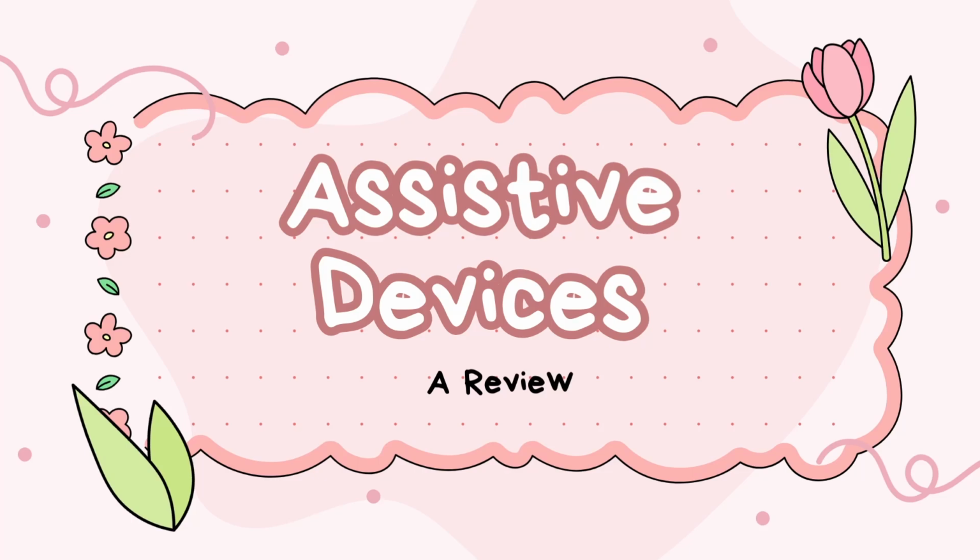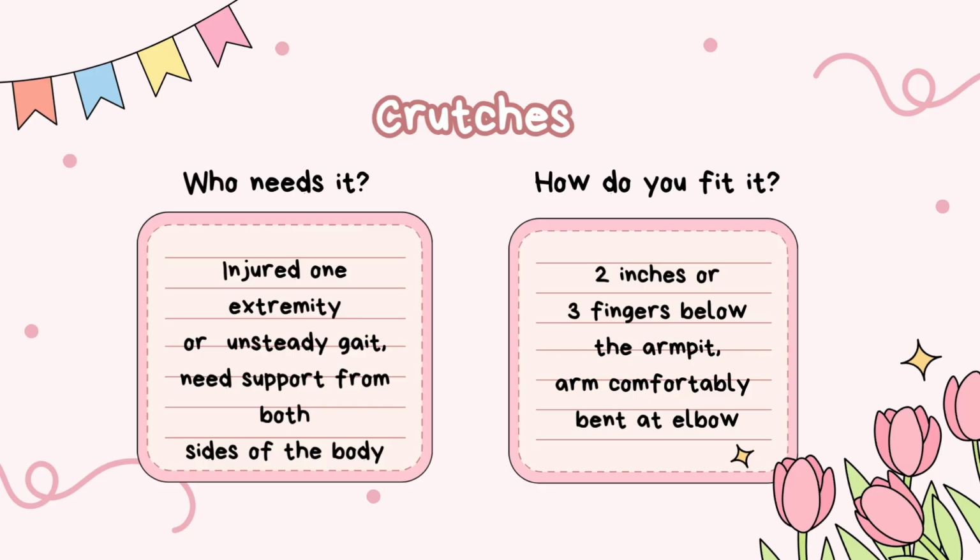Welcome to our review on assistive devices. We're going to start by reviewing crutches.